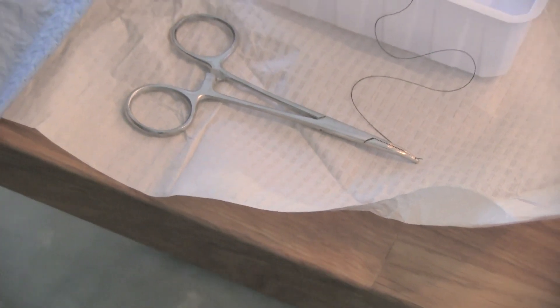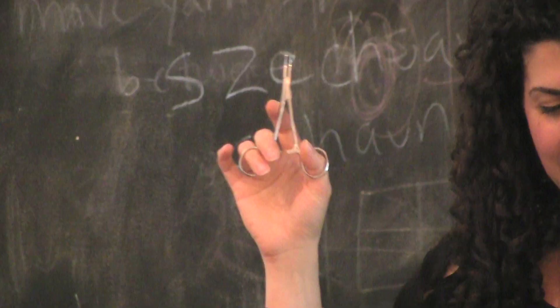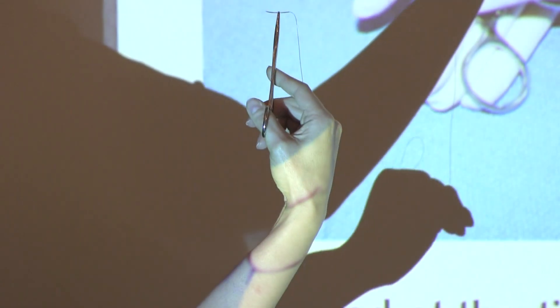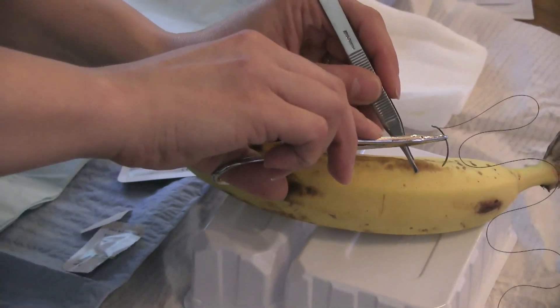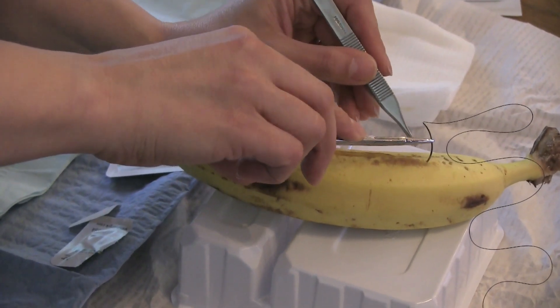Okay, time to stitch. Hold down one end of your stitch material with a rock or book or whatever. Attach your needle to the other end. Hold your needle driver or tweezers like this. With the tip of your tweezer or loader, grab about halfway down the needle. Lift the edge of the skin a little bit like this — which is gross and painful, but helpful. Then cock your wrist and drive the needle into the skin at a 90 degree angle.